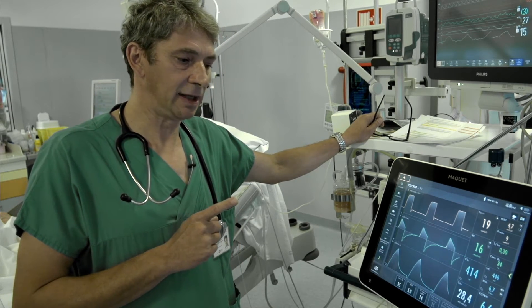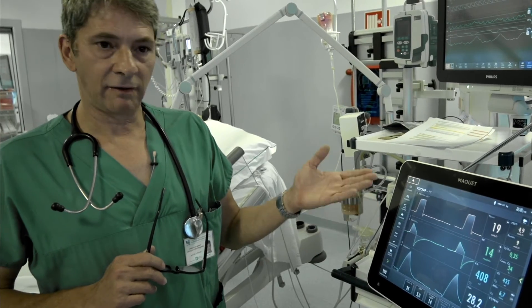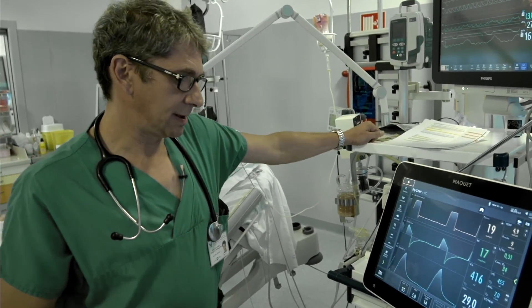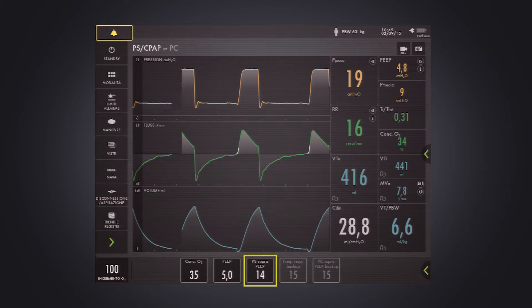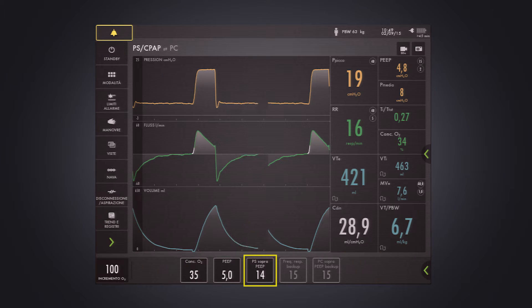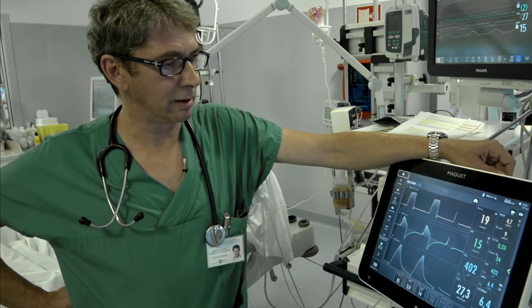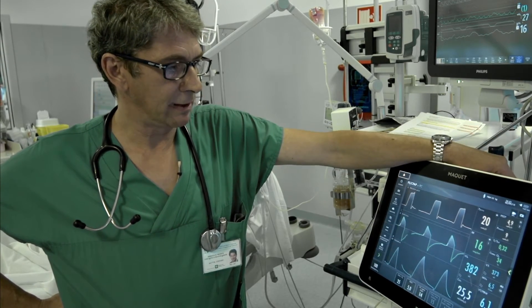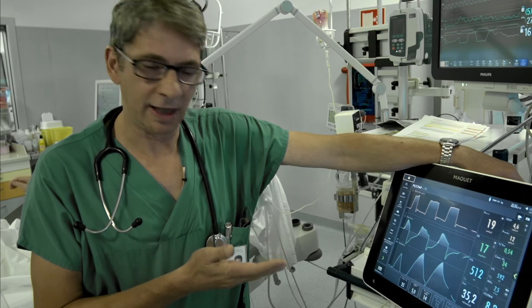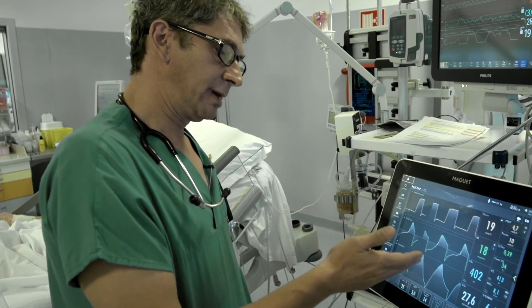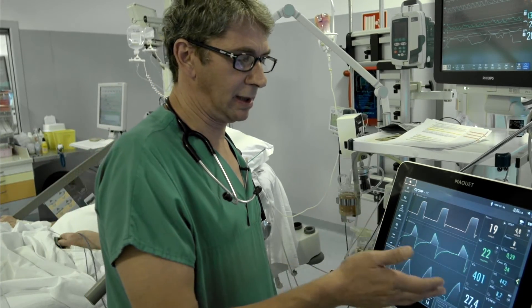She is now on assisted ventilation with pressure support, and we can see the parameters on the ventilator. The patient is on five centimeters water of PEEP, a low FiO2, and pressure support of plus 14 centimeters water above PEEP. The respiratory rate is below 20 and the tidal volume is 6 to 6.5 mL per kg of predicted body weight.